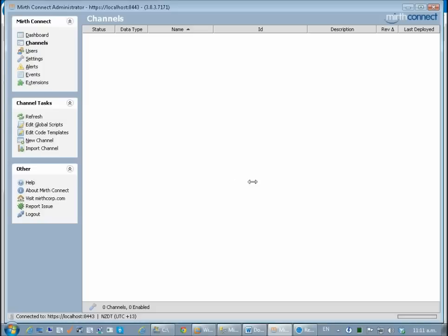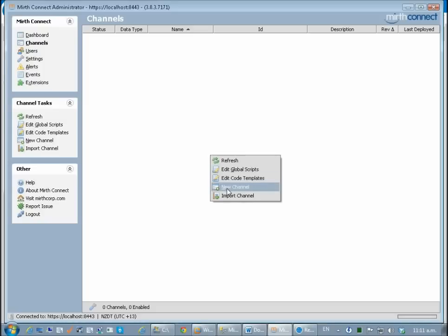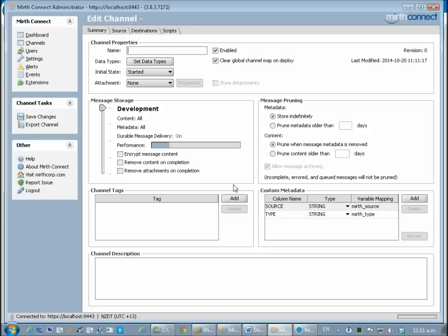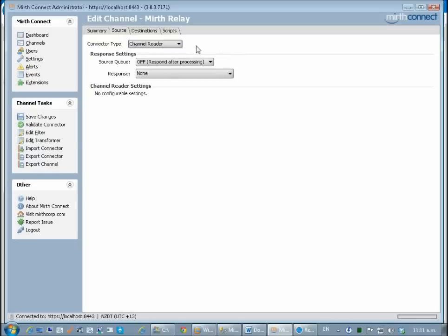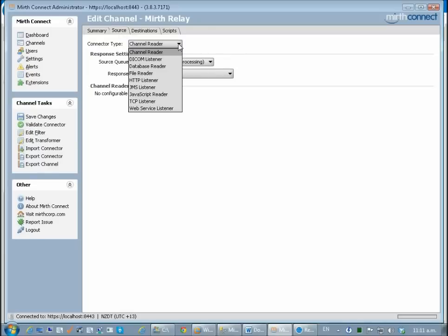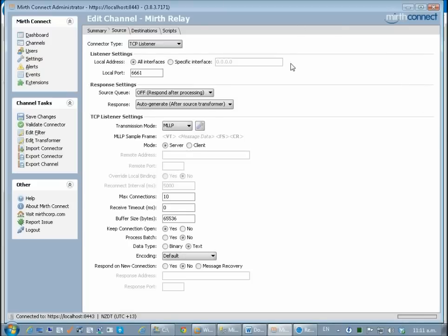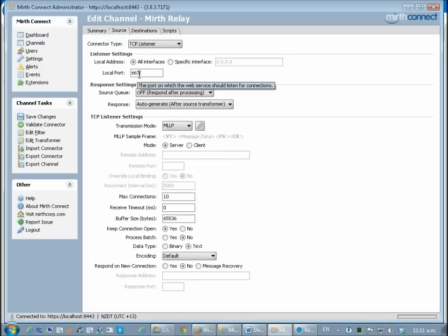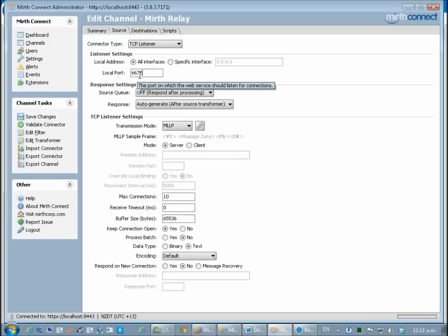First of all I'm going to start by creating a new channel and I'm going to call it Mirth relay. I'm going to go to the source and I'm going to set this one as a TCP listener which is the standard transfer for HL7 messages on MLLP on port 6661. I'm going to change that across to port 6672 for my message.